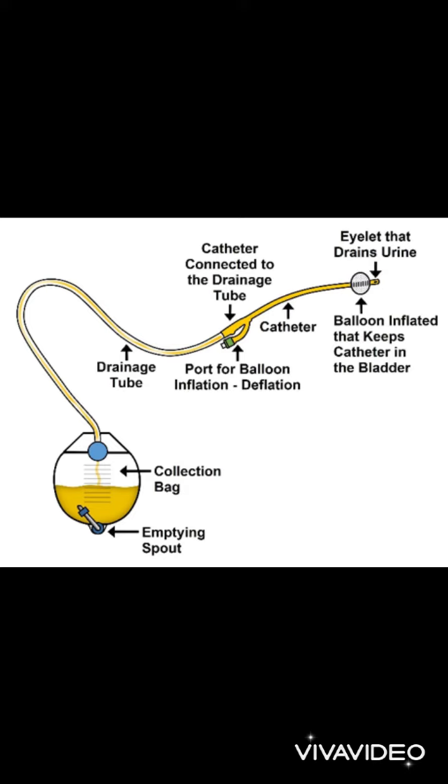If the patient has a urinary catheter in place, then urinary output can be measured by observation of the measurement markings on the collection device. Some catheters have a single bag which all urine drains into immediately, whereas others have a separate chamber that urine drains into first. The first chamber can then be emptied by opening the valve, allowing the urine to move into the larger catheter bag. Catheters with a separate measurement chamber can make it easier to assess a patient's rate of urine output.